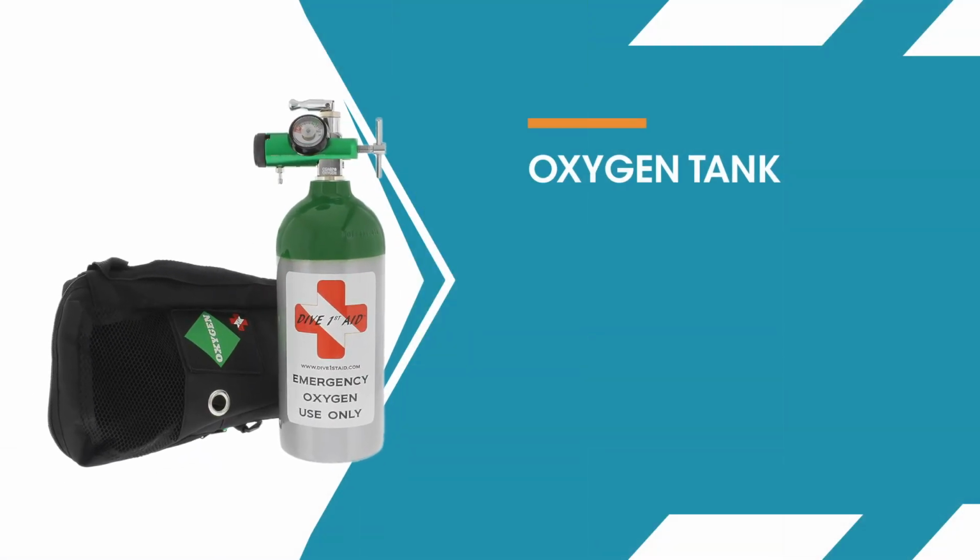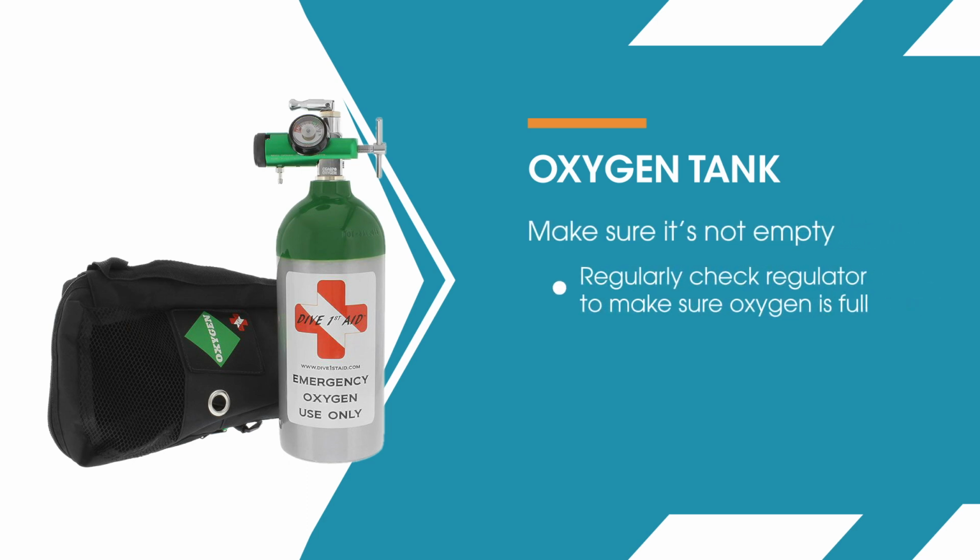In a basic emergency kit, you have an oxygen tank, and usually it's an E-tank. If you look at the dial on it, it will say that it's empty. So it's not empty, probably. What you need to do, there should be a regulator on it. You turn it counterclockwise, you should hear like a hissing. It should go up to the green and show that it's full. Then you turn it clockwise to shut it off, and you know that your oxygen is full. That has to be done on a regular basis to make sure there's no leaks or anything.